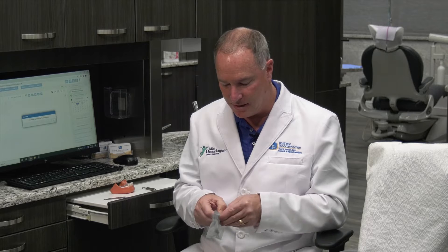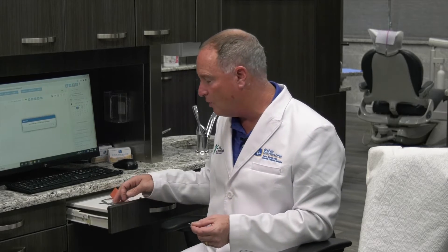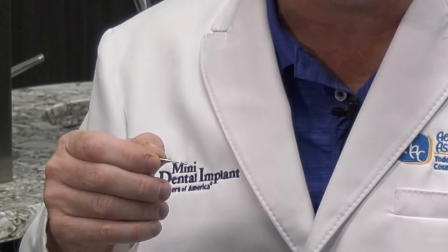Why is it that we use it for a single patient? It's because these pilot drills are very, very thin and if you start autoclaving them, they can become very brittle and they could possibly break off in the patient's jaw, and you don't want that to happen. If they break off in the patient's jaw, you're going to have to go retrieve it and that can be difficult. That's why we recommend using a brand new one for each patient.